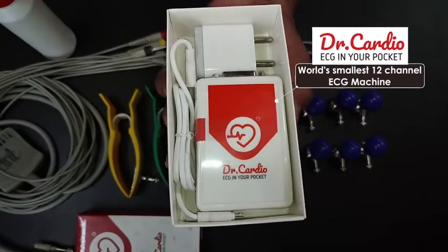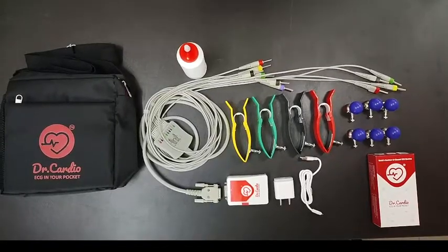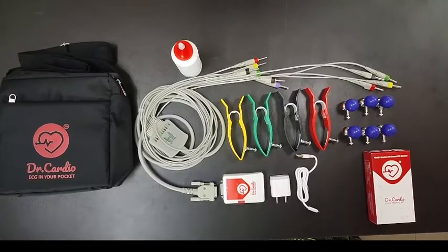Note that the ECG machine is covered by a 2-year replacement warranty. An extended warranty can be bought from us at the time of purchase.